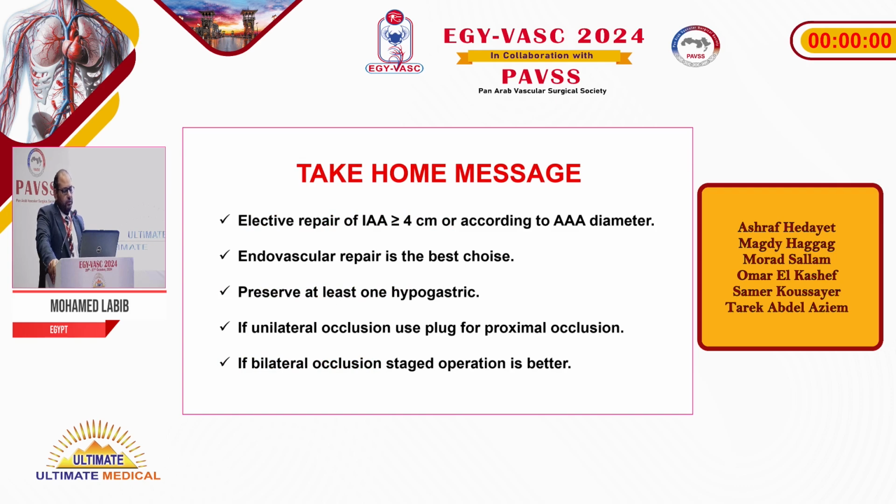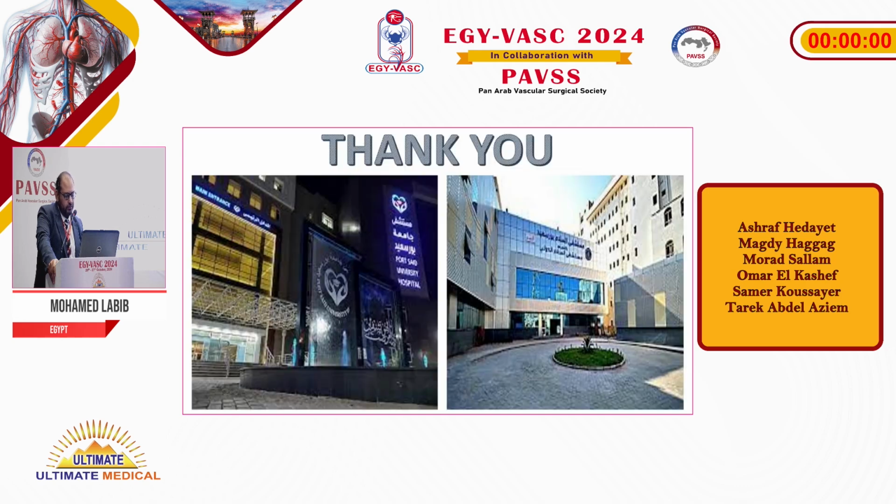So my take-home message for today is: elective repair of an iliac artery aneurysm if it is more than 4 centimeters, or according to AAA diameter. Endovascular repair is the best choice. Preserve at least one of the hypogastric arteries. If unilateral occlusion, we have to use proximal occlusion of the main stem. If bilateral occlusion, a staged operation is better. Thank you.